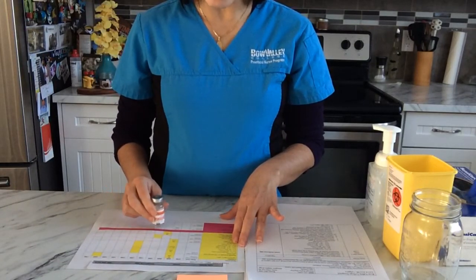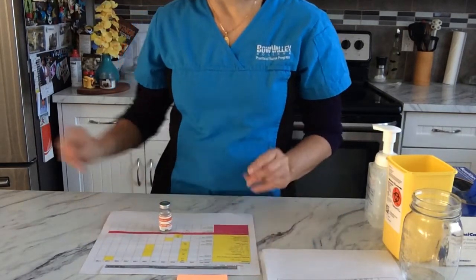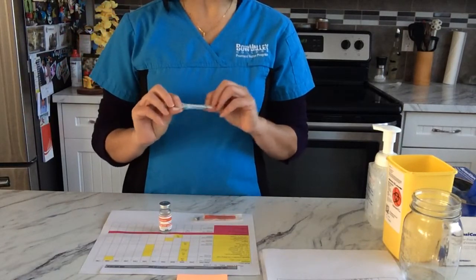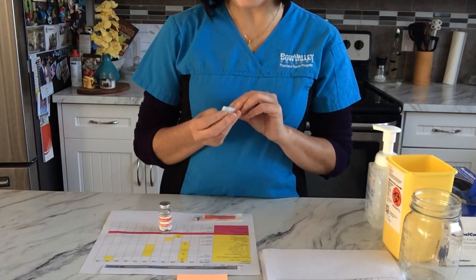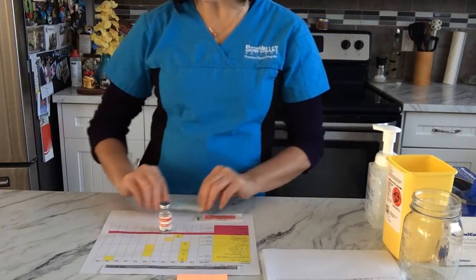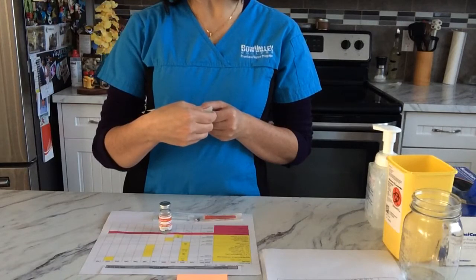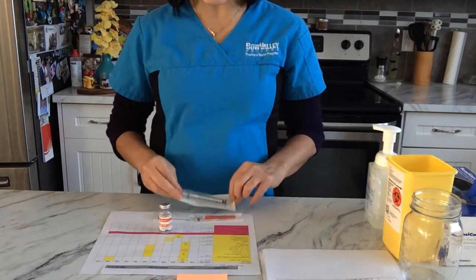Now that I have done my second check, I'm gonna get ready to withdraw the medication. I have a blunt fill needle I'm gonna use. I also chose a 25 gauge, 5/8 inch needle. This is for subcutaneous injection. And I also have my syringe, 1 ml, expiry date April 2024. Some of my supplies have been open already since I've been practicing.